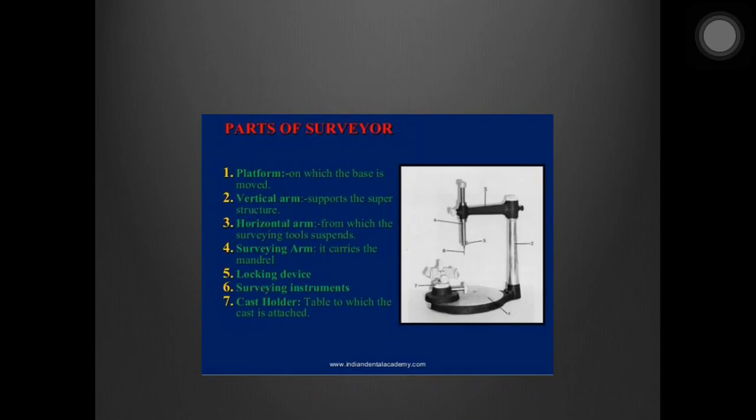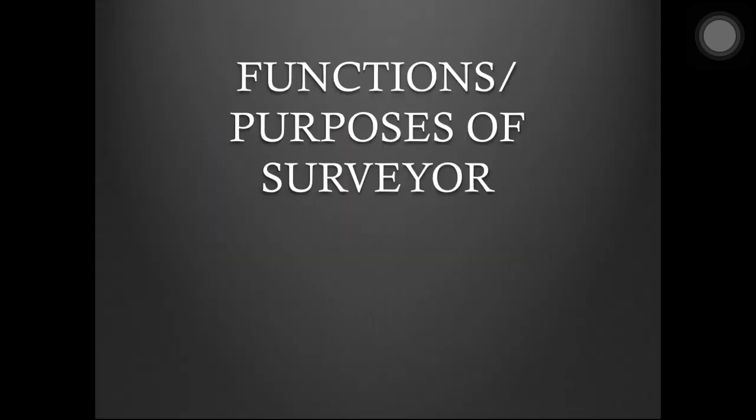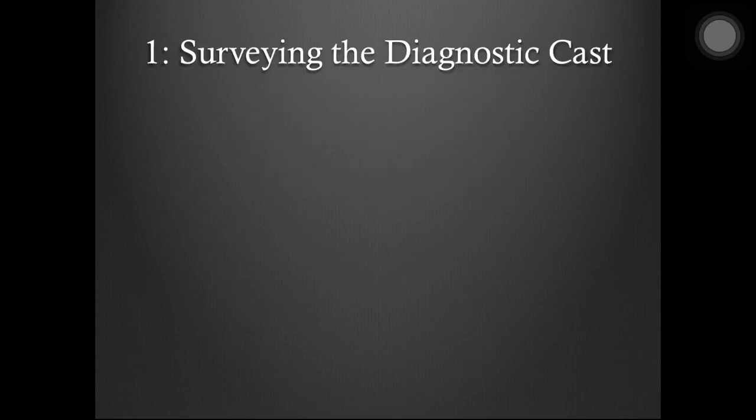Moving on, what are the different functions or purposes of using this instrument? First of all is surveying the diagnostic cast, as I was talking about. At this point, as third year BDS students, you have to understand the specific terms we use during dental communications.